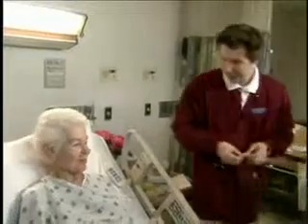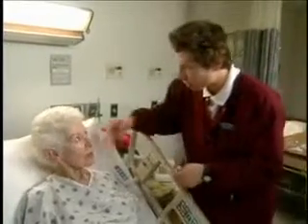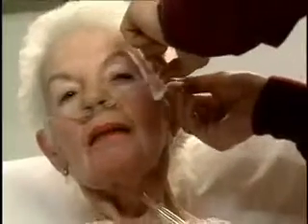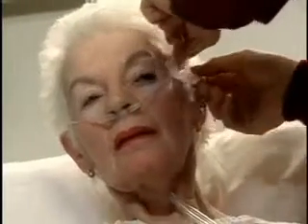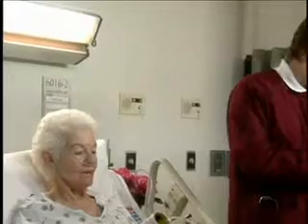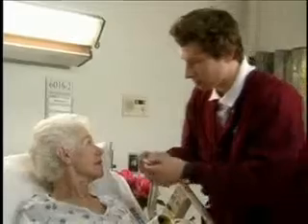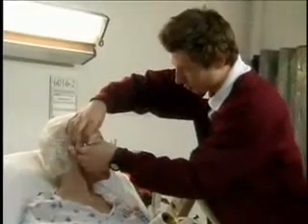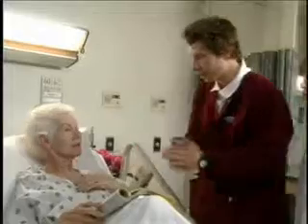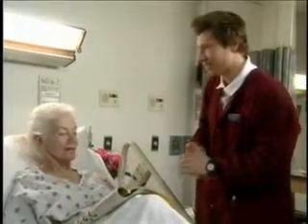Okay, now using gauze pads, I'm just going to put them under the tubing of your ears to relieve the pressure. Okay. Can you look towards me, Mrs. Keene? Thank you. All right. How's that feel? Oh, a custom model.